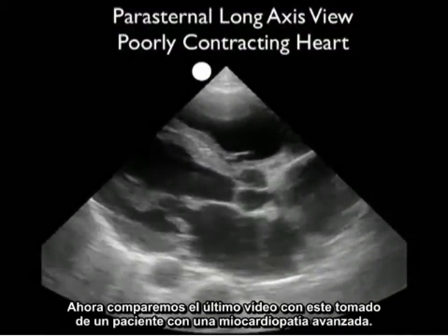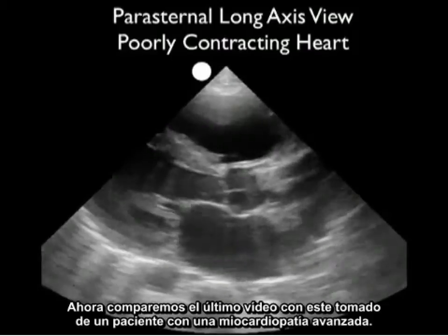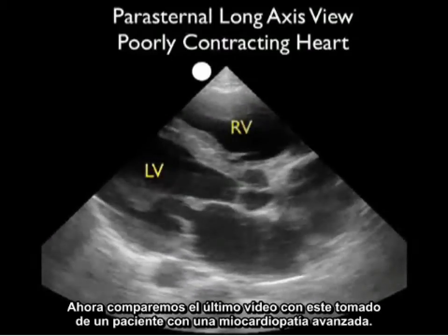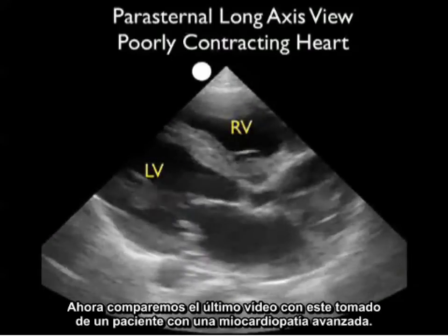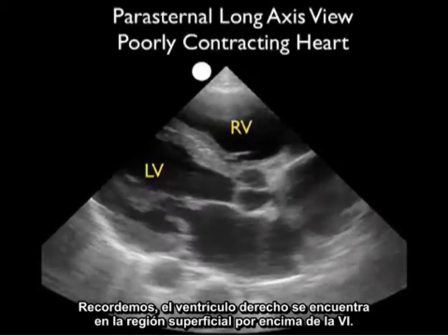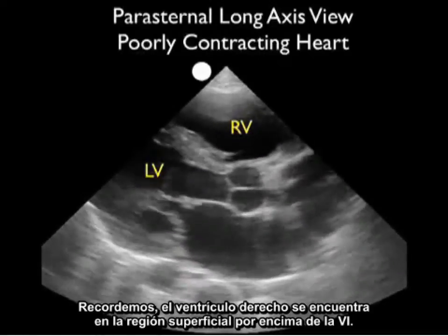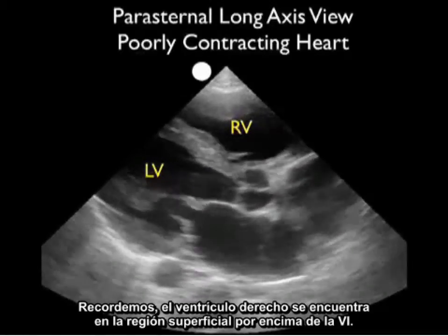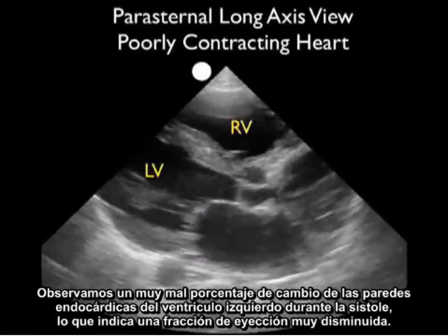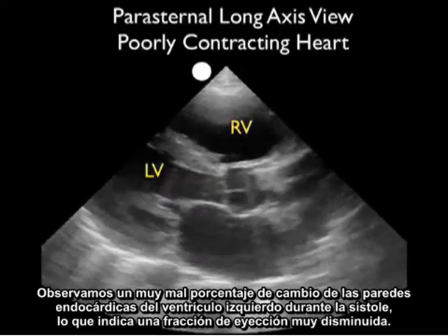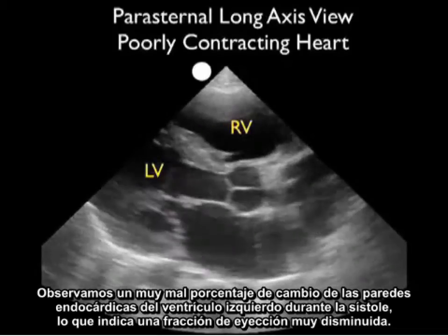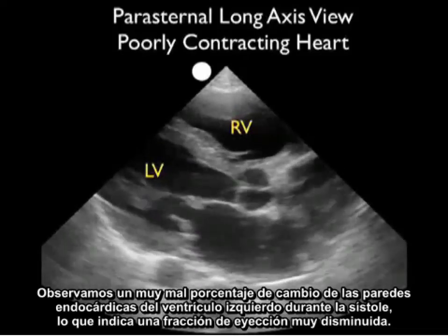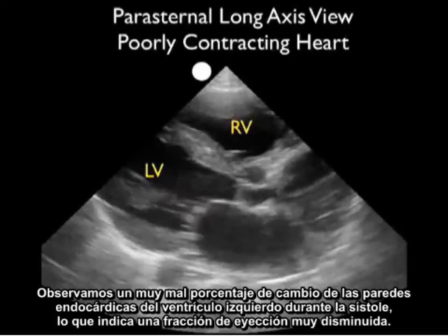Now let's contrast that last video clip with this one taken from a patient with an advanced cardiomyopathy. We can identify the left ventricle and the right ventricle in a superficial location above the LV. Notice the very poor percentage change of the endocardial walls of the left ventricle during systole, indicating a very decreased ejection fraction.